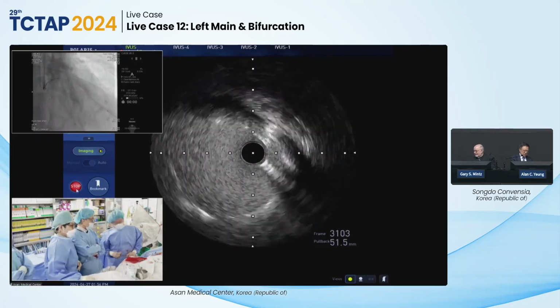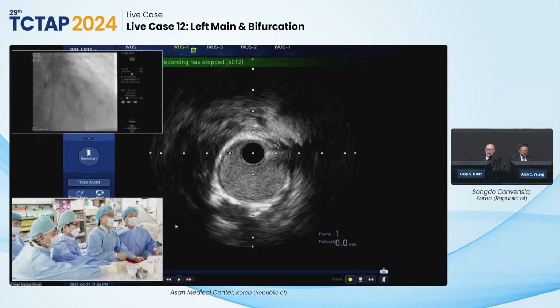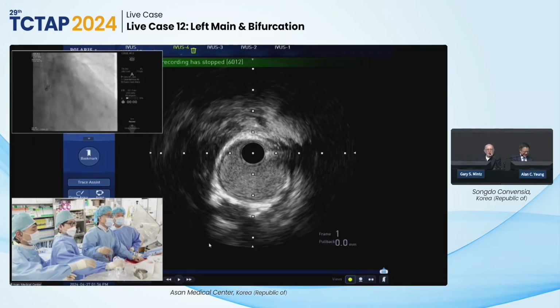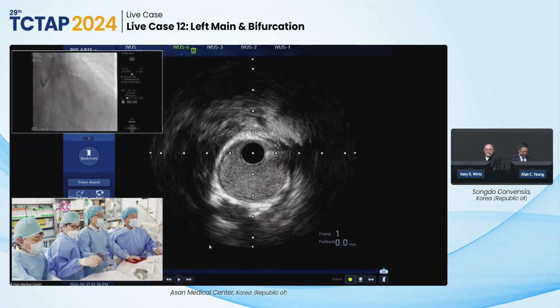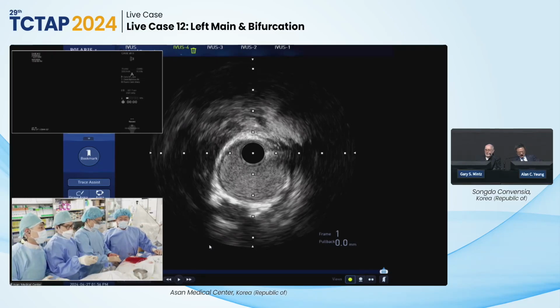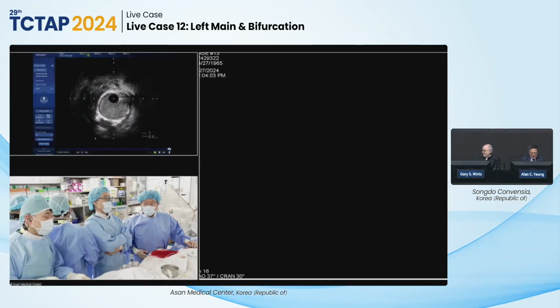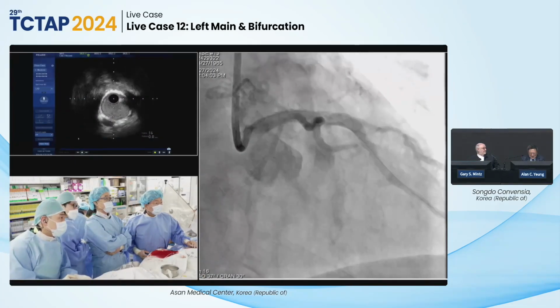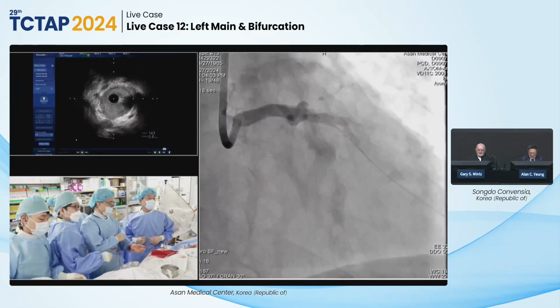All right, I think. Gary, do you like it? No, I don't like it. So you need to use a bigger balloon at lower pressures. And I would even argue you'd probably use a 5 millimeter balloon at about 6 atmospheres. Okay. Picture first. Okay. Ooh, big battery. Yes, I'm very happy.